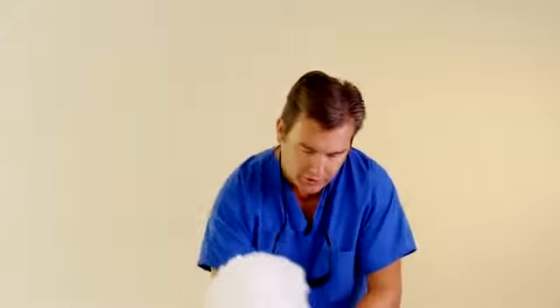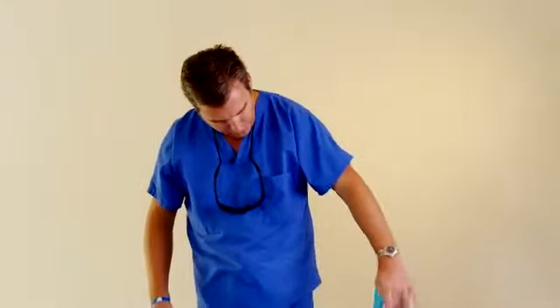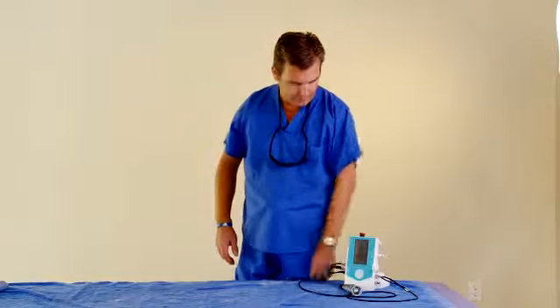So we're going to lose our patient here. She's ready to go home. I'm going to send her on her way. But when you get done, again, your joule counter will have the joules, record that, and then you can turn it off, and you're done with the treatment.